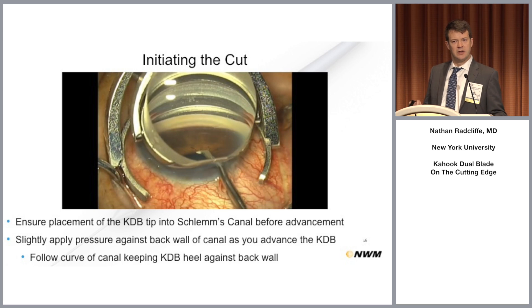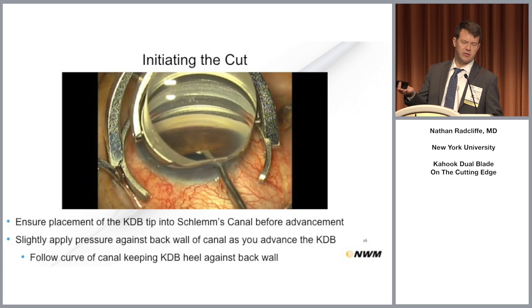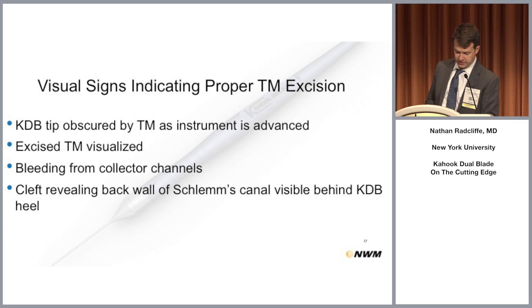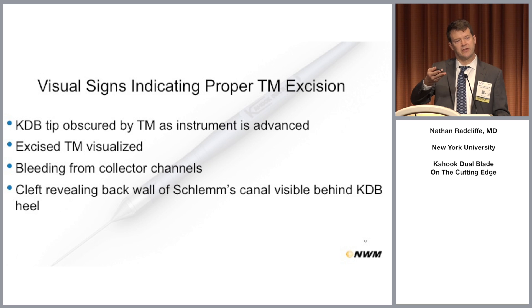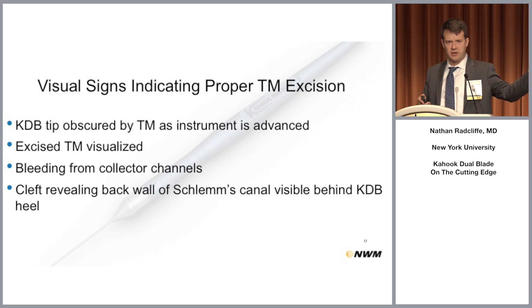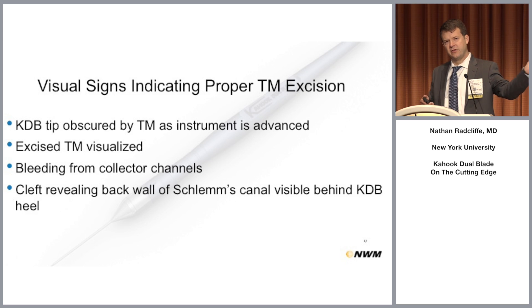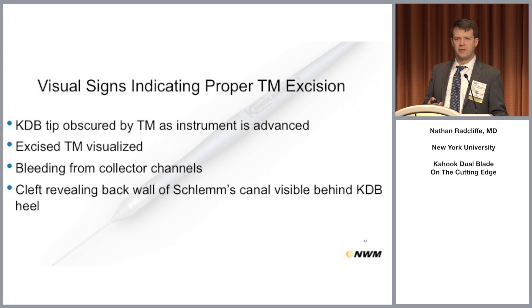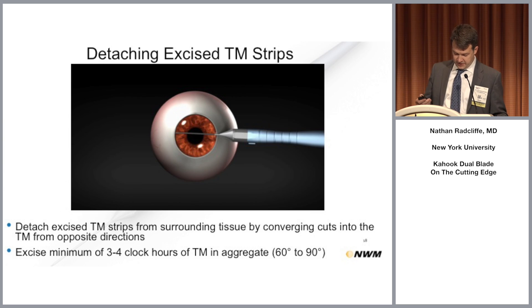If you have bleeding during the surgery, apply more viscoelastic and brush it out of the way — you'll also be raising the pressure, making reflux bleeding less likely. Once you've gone through one pass, you'll have a strip of trabecular meshwork. Come from the other angle a little further along, pierce the trabecular meshwork into the canal again, sweep across, and remove that final strip of trabecular meshwork. You don't always get the strip.